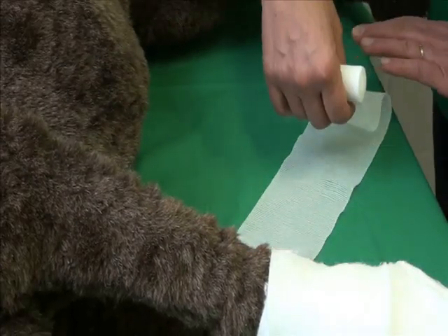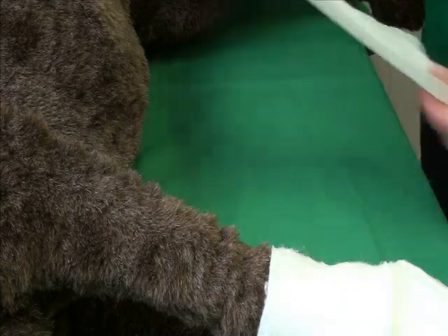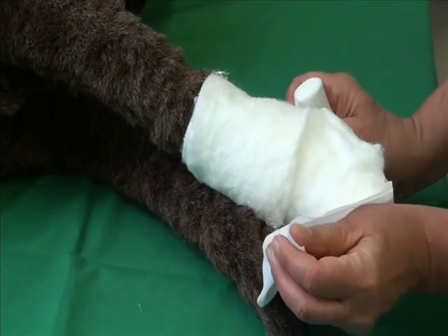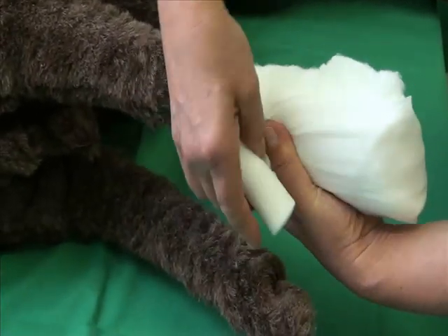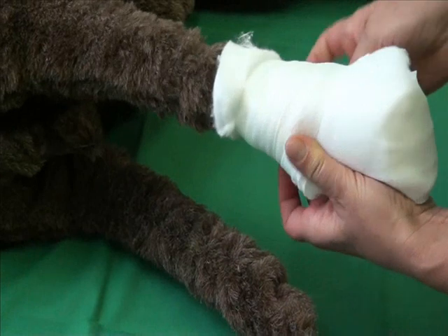The padding is covered with a conforming bandage to hold it in place. Again, a double layer should be used to start. The paw and metatarsal bones are wrapped in figures of eight. This method of winding helps to prevent the bandage from slipping.